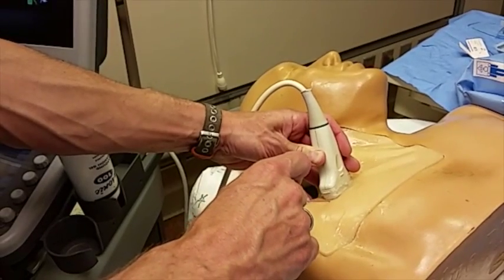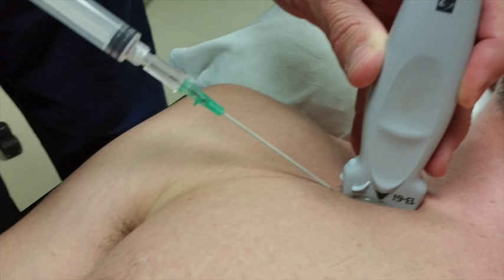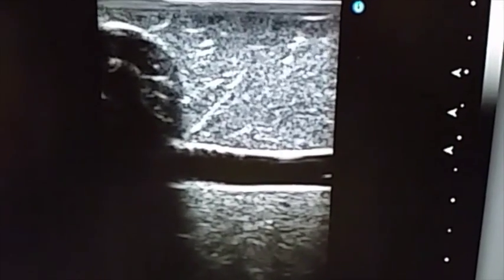Now is the really challenging part. Very slowly advance your needle at a 45 or so degree angle until it enters the vein. The needle will need to be kept exactly, perfectly, completely, 100 percent in axis with your ultrasound probe.